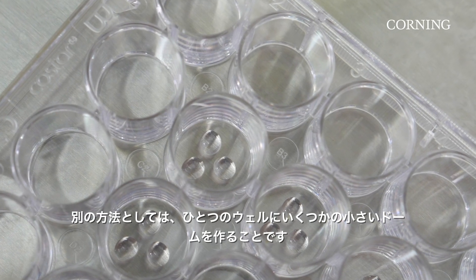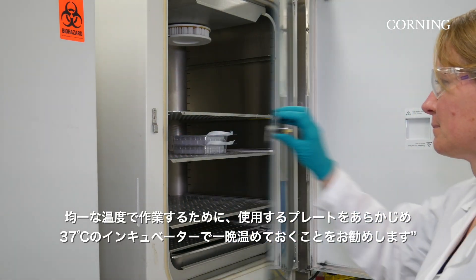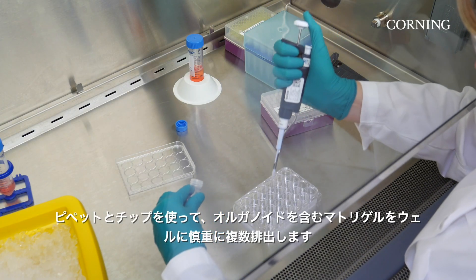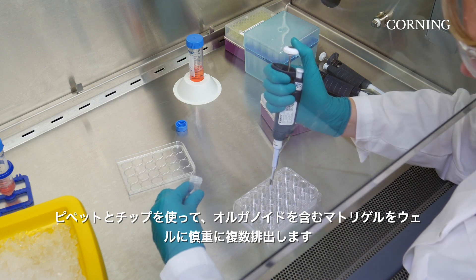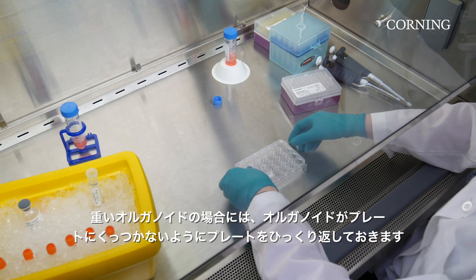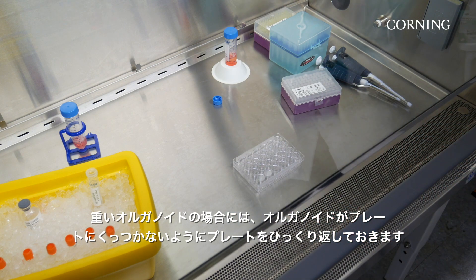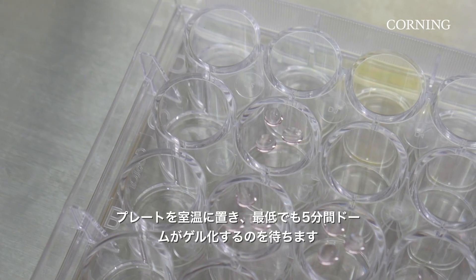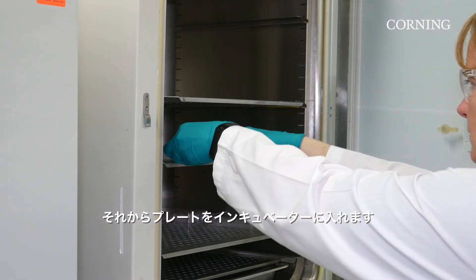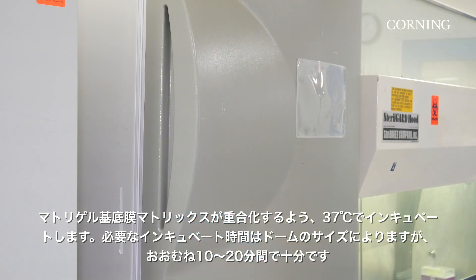Another option is to create several smaller volume domes per well. With this method, it is still recommended to pre-incubate your plates at 37 degrees Celsius the night before. Working with a pipette and tips, carefully dispense several droplets of Matrigel Matrix for organoid culture, which includes your organoid mixture, into the wells. When working with heavier organoids, invert the plate so the organoids settle away from the plate surface and do not attach. Let the plate sit at room temperature for at least 5 minutes until the domes have gelled, then place the plate into the incubator.